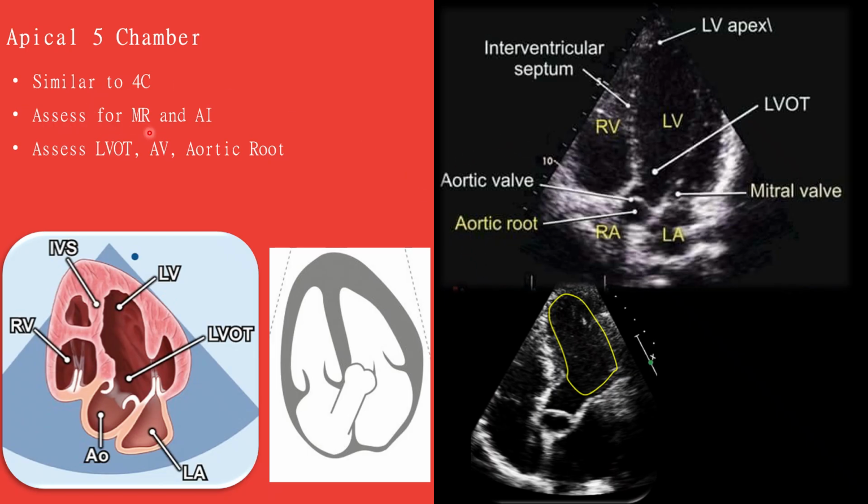Assess for mitral valve regurgitation and aortic insufficiency. We will assess also for the left ventricular outflow tract, the aortic valve, and aortic root.